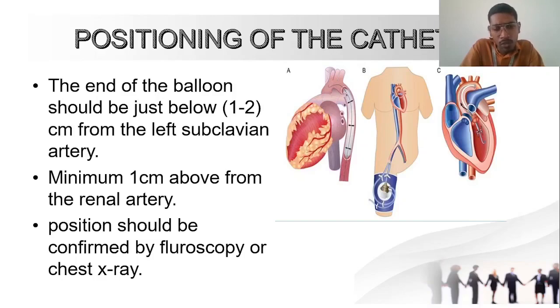Fluoroscopy is used in angiographic procedures, and we can also use a chest X-ray.